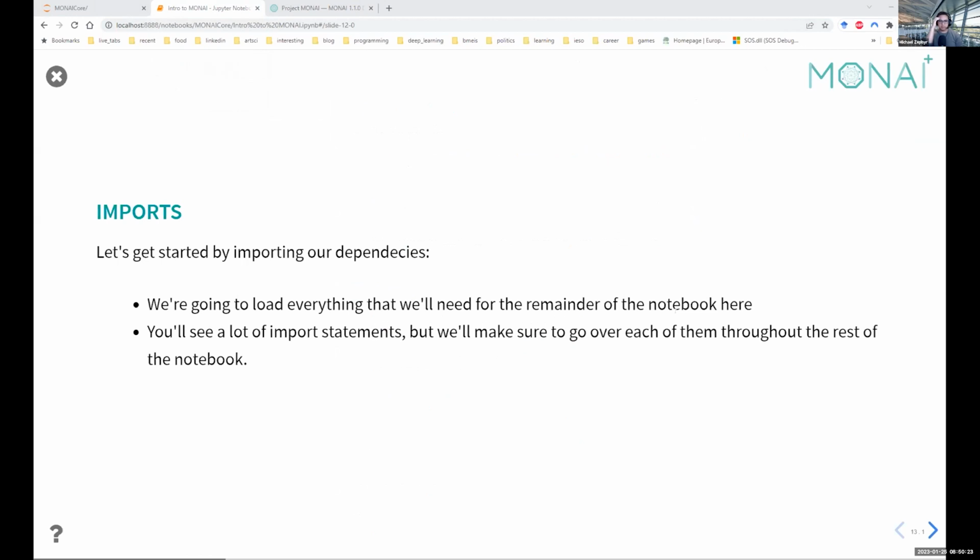In the GitHub repo that I linked to that we're basing this off of, at the very bottom, there's an install a local environment instruction list that talks about how you install things for MONAI core, MONAI label, MONAI deploy. So if you click on MONAI core installation, you can follow that guide for setting up your environment. We don't have a YAML or requirements text file in this repo, but there are some other ones within the MONAI repo, depending on how you want to set up the environment. So I encourage you, I'll put those links in Zoom and Discord as well. If you are setting up your own environment, take a look at those documentations.